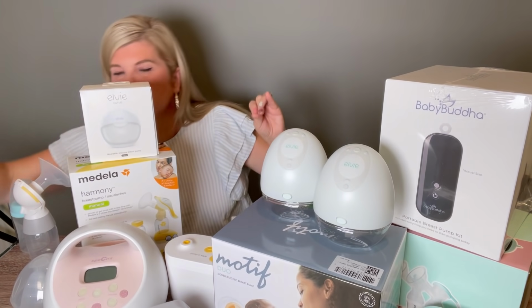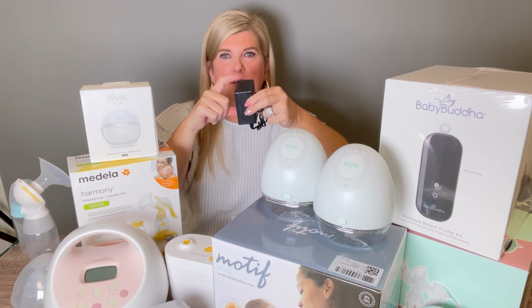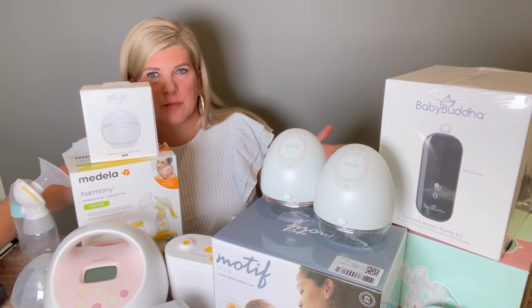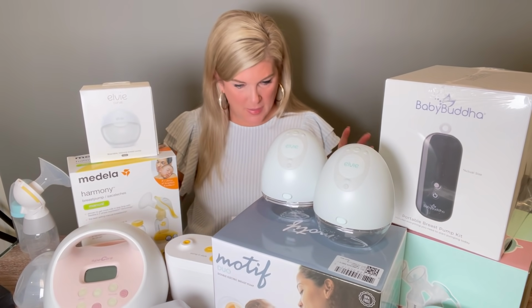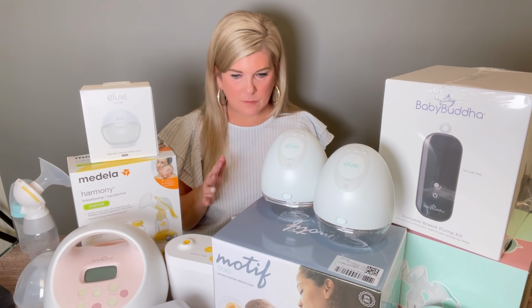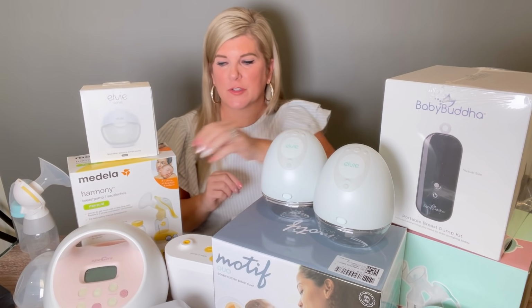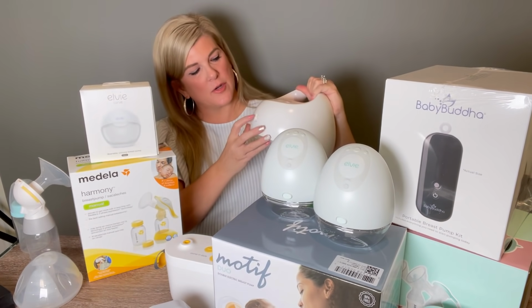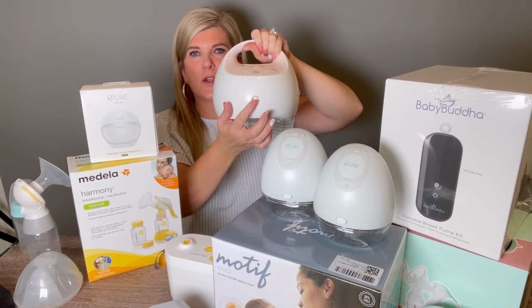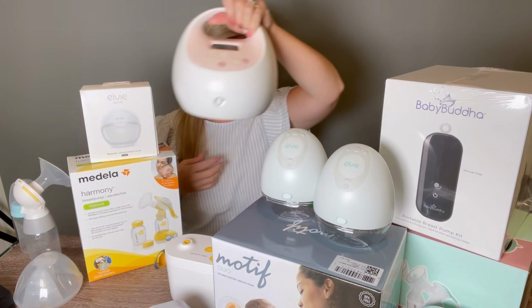And then you get, of course, your adapter too, which plugs into the wall. This new one by Medela, you can put batteries in here. It's a battery pack, which helps make your breast pump portable. So those are the functioning components of an electric breast pump. If you want to use it as a single breast pump, like this one on the Spectra, I don't know if you can see this, but it's got two little holes right here where your tubing would go in. So you just close off one of the holes, so you won't get any suction out of that.